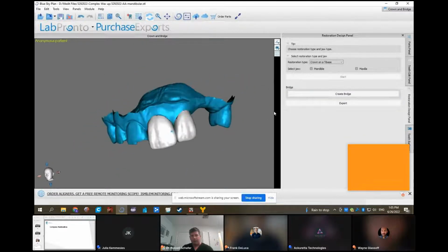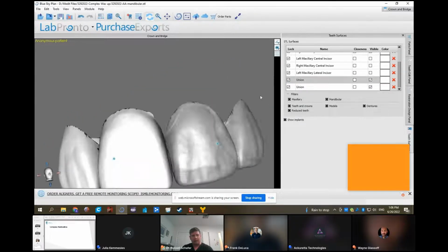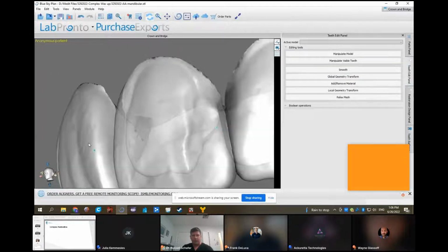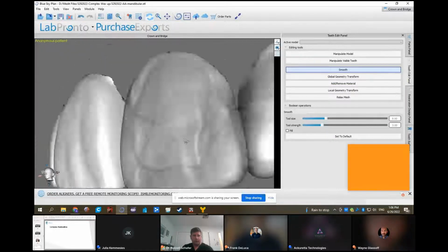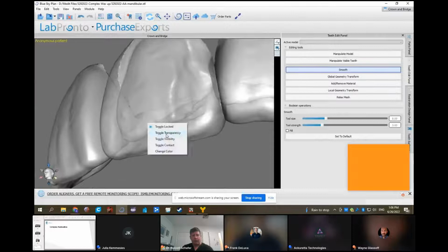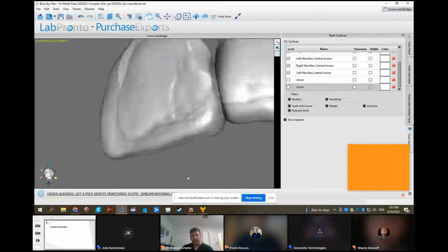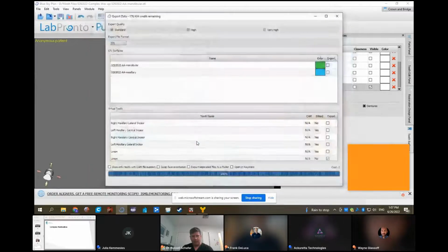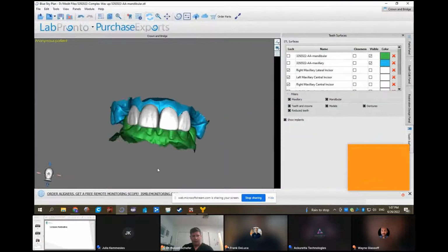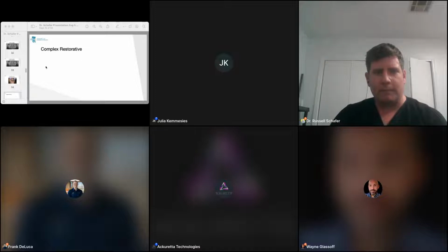Make sure you get rid of all undercuts, because for some reason they have a 0.1 millimeter undercut, which I don't understand, but if you do it once that way, you will learn they won't seat. And right here, I'm just trying to change the contact up a little bit because I want 8 and 9 just barely touching each other like a regular contact would be. And I export them both out. And from there, that's about all that's involved right there.